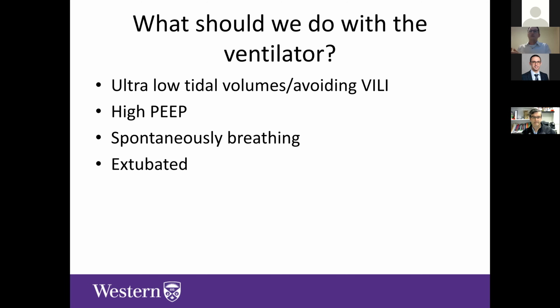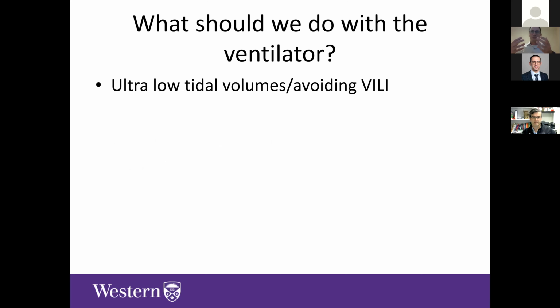There's a push to try them, but again, the evidence is really in this idea of just letting the lungs rest, letting them recover, and waiting for the function to return. And in the case of COVID, a lot of centers are not seeing function return for 6, 8 weeks, and even months. And it's a real struggle to decide what to do. And a lot of centers that have high volumes of these, it's just accepted that you just have to wait until either you have complications that say that you can't go on, or wait until they recover if you just have single organ system dysfunction. And the lungs will tell you when they get better, because their compliance will improve and your tidal volumes will come up.